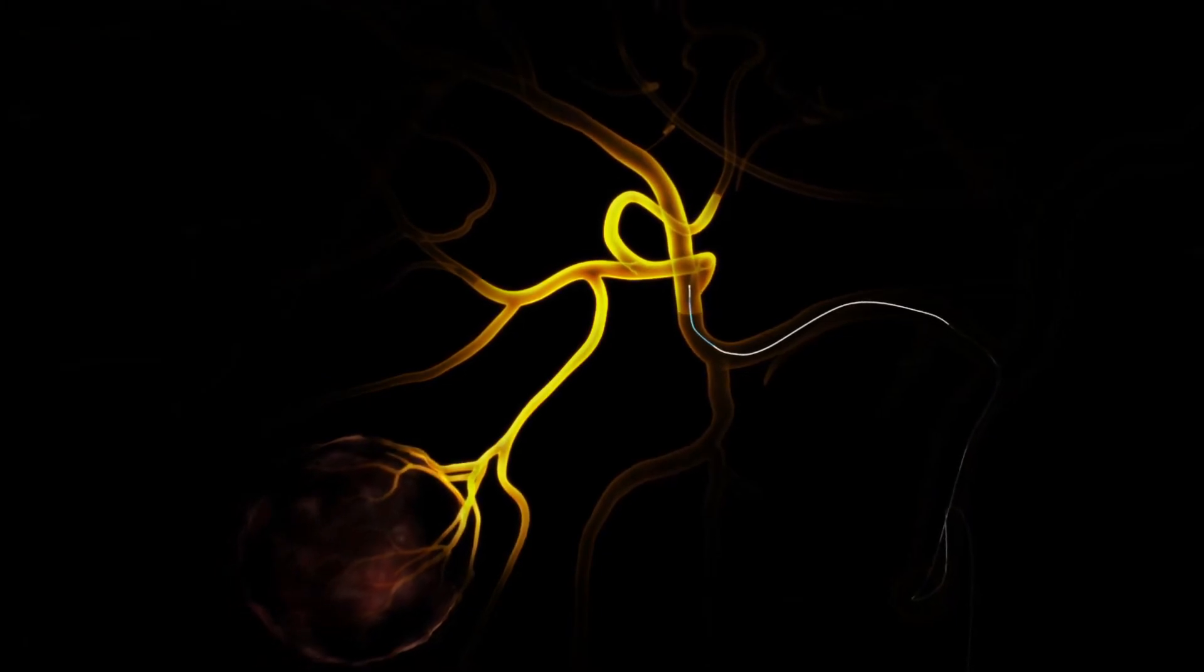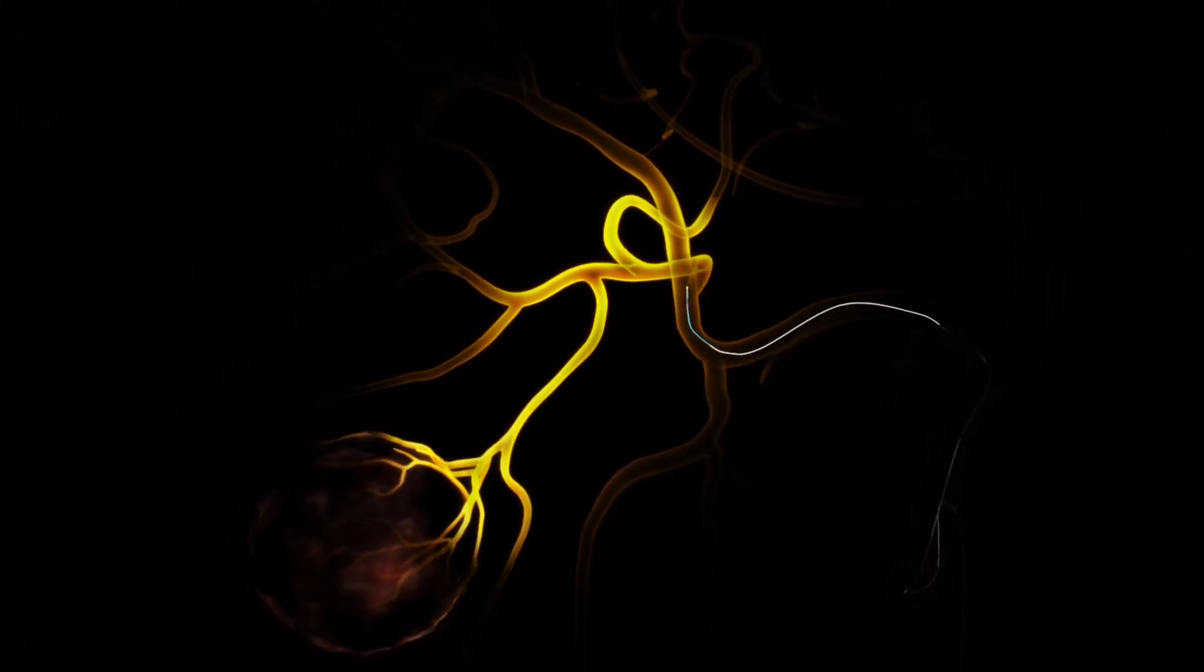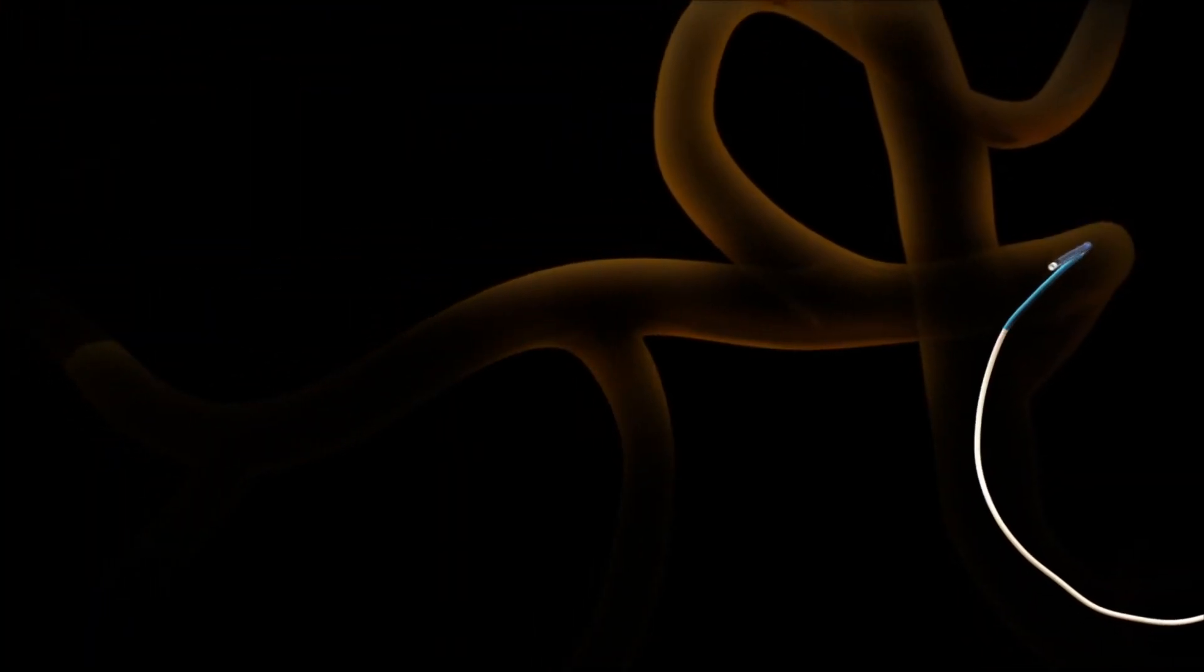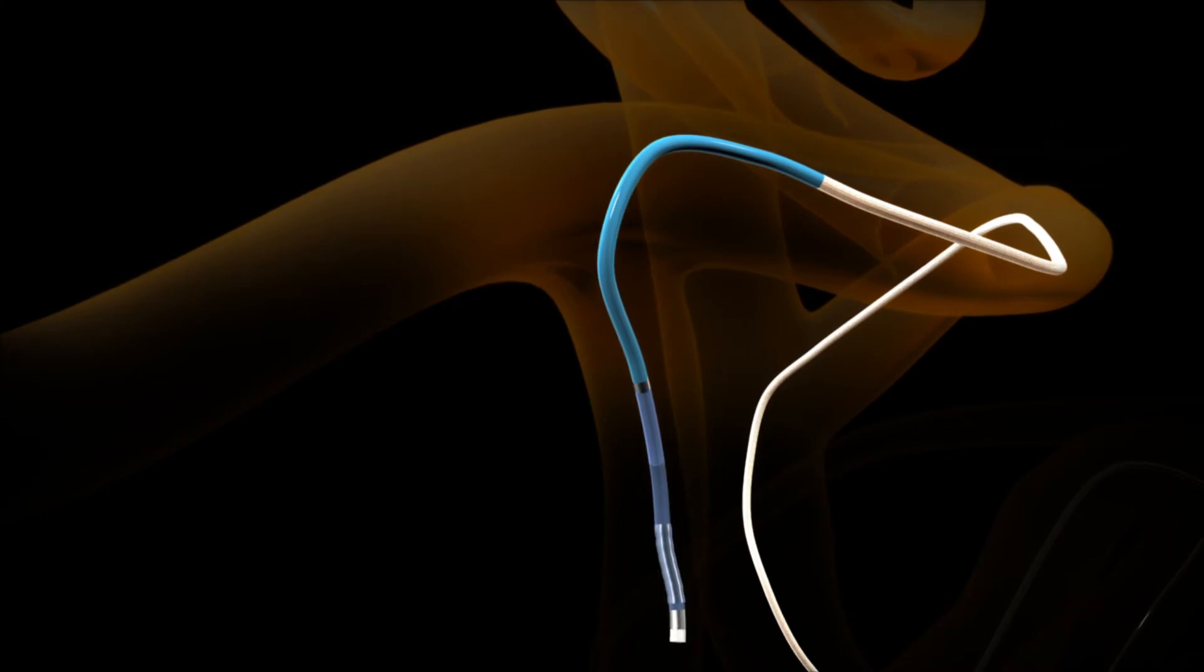While watching under fluoroscopy, control the articulation of the tip by manipulating the steering dial in the catheter hub. The ability to articulate and track the Swift Ninja through vessels can reduce the number of guidewire and micro catheter exchanges, potentially saving procedure time and product costs.